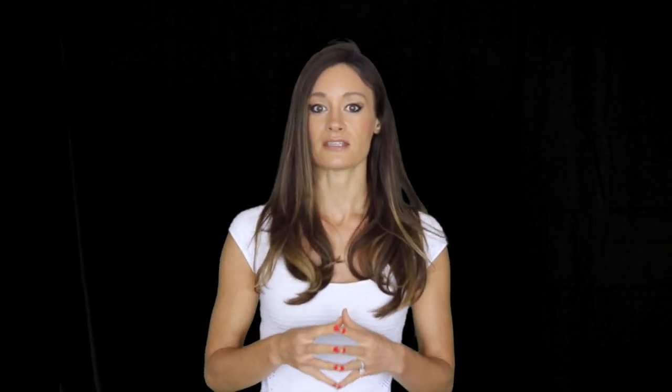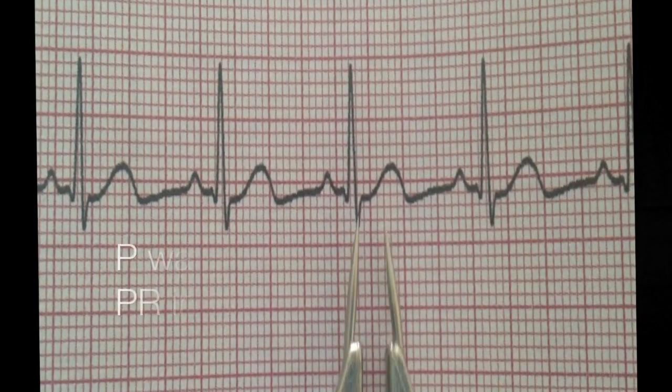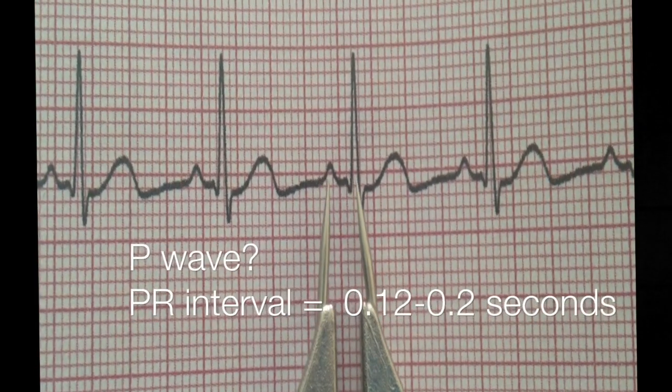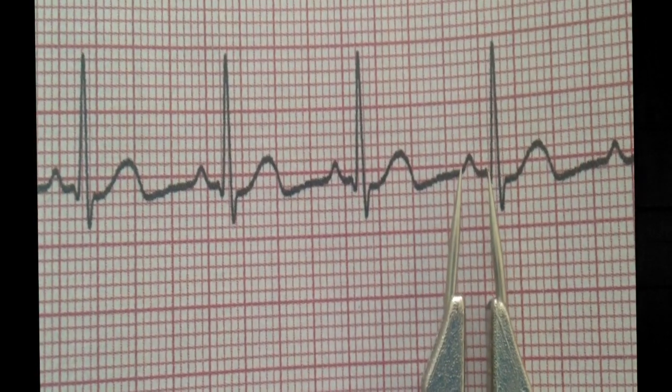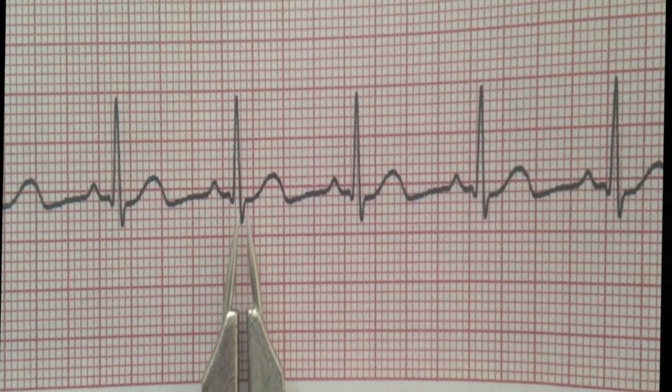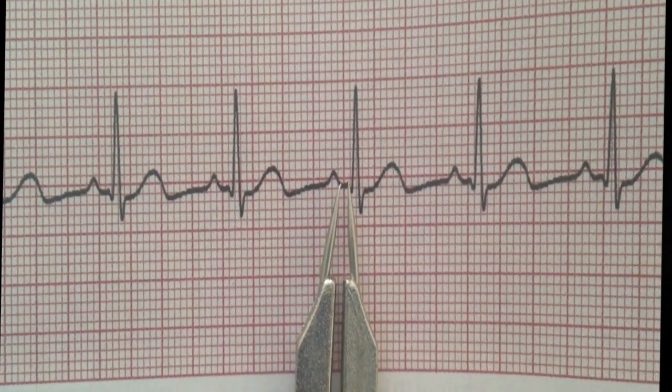The next step is: is there a P wave? Do you see a P wave before each QRS complex? Step 4: what is the PR interval? Normally the interval is 0.12 to 0.2 seconds, or 3 to 5 small boxes. It is important to look at a few PR intervals for comparison. Lastly, is there a QRS complex following each P wave, and what is its measurement? A normal QRS complex is between 0.06 to 0.12 seconds, or 1.5 to 3 small boxes.